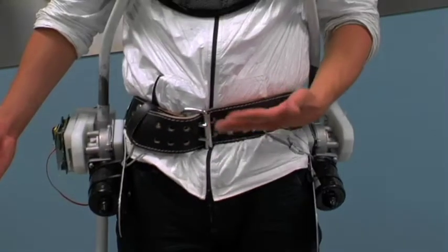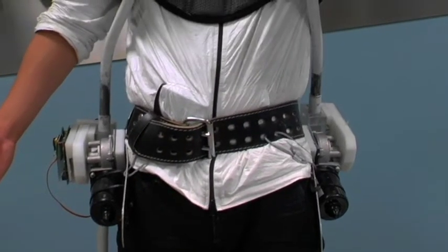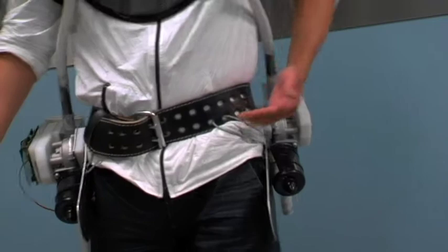We chose this particular design because it has pads on it — pads in between — so that it wouldn't hurt either your chest or your butt area.